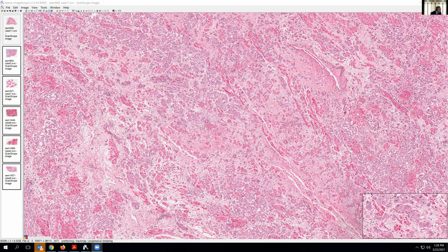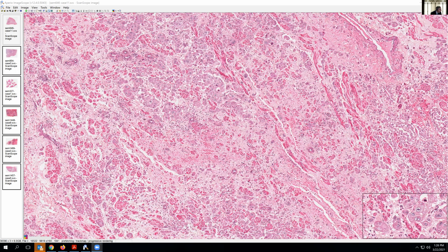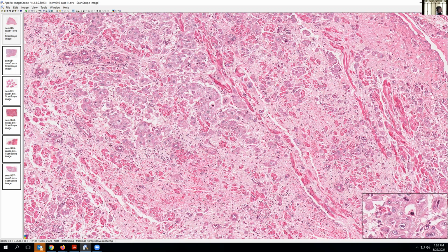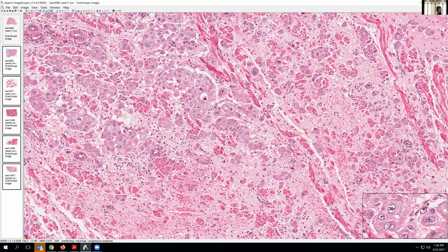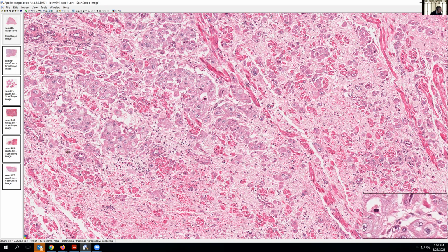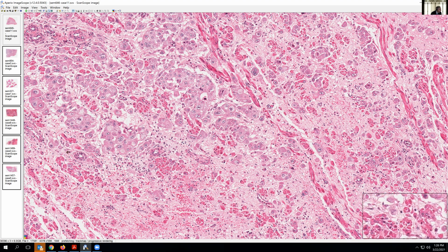You can see the very rare residual myometrial cells here, and interspersed between them are these very large, quite atypical cells with very large nuclei, occasional multinucleate cells, and quite abundant, very eosinophilic pink cytoplasm. So you see this sort of a pattern, you'd think, oh, is this metastatic carcinoma? Is this an infiltrative neoplasm that's metastasized to the uterus? And so this is where your differential of including this possibility would come into play.